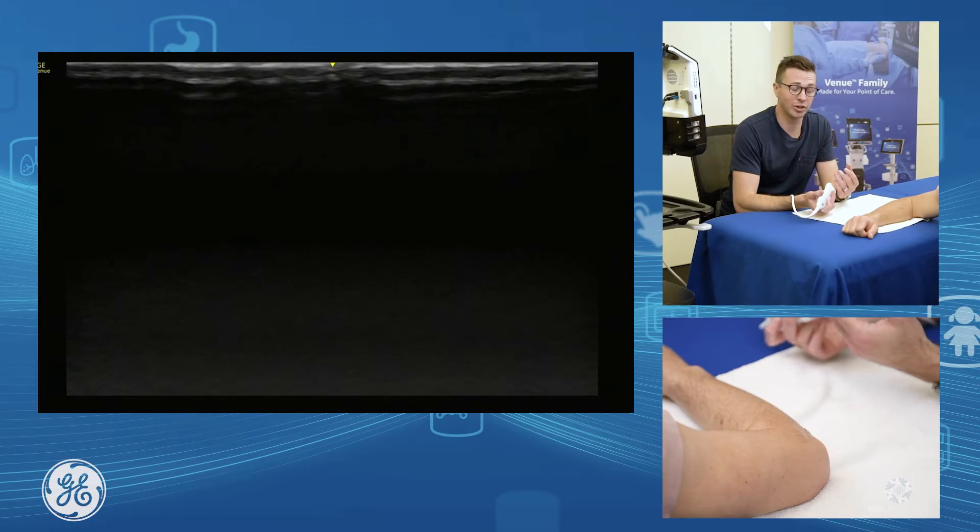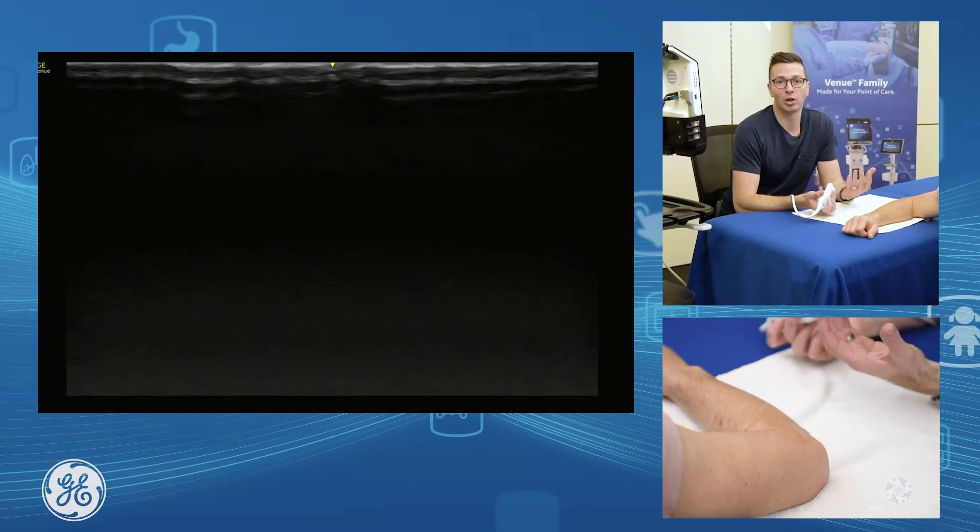Ultrasound assessment of lateral epicondylalgia — our primary focus is our common extensor tendon.